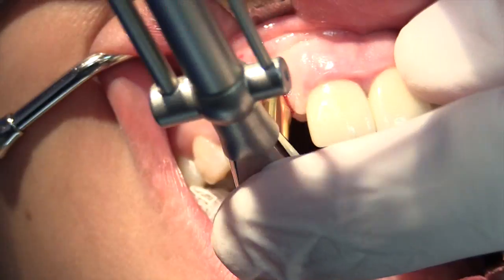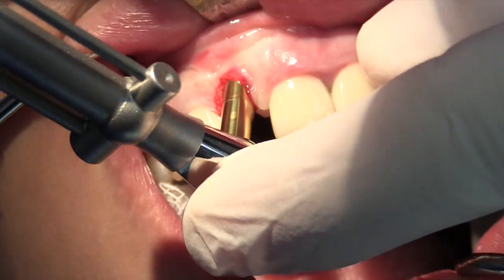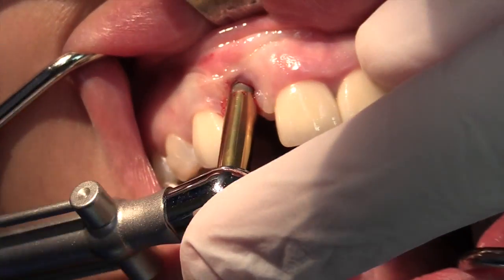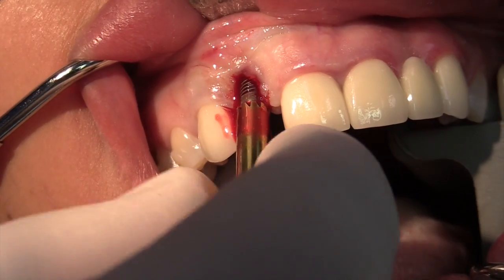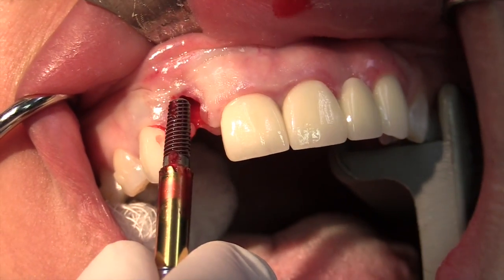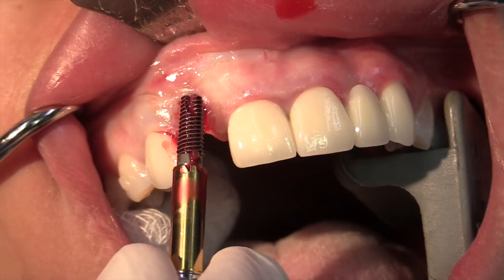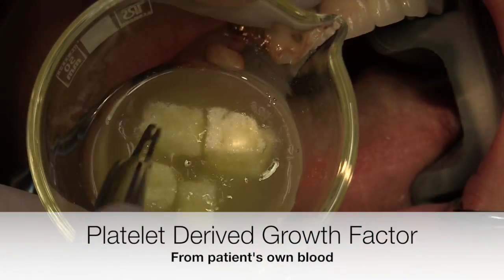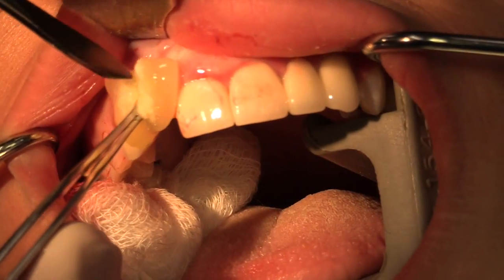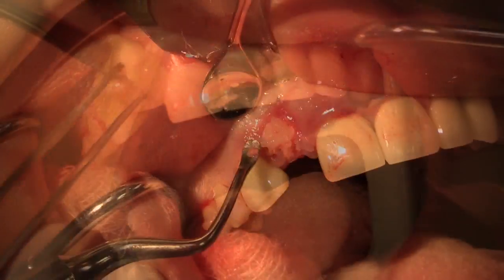Next, we'll use a wrench and rotate it as it applies appropriate reverse torque forces to the implant. The mechanical bond between the implant and the bone is eventually disrupted and the implant is rotated out of the site. We'll clean the site gently and irrigate it, and finally apply some platelet-rich growth factor, which is obtained from the patient's blood, and this enhances tissue healing and maturation.